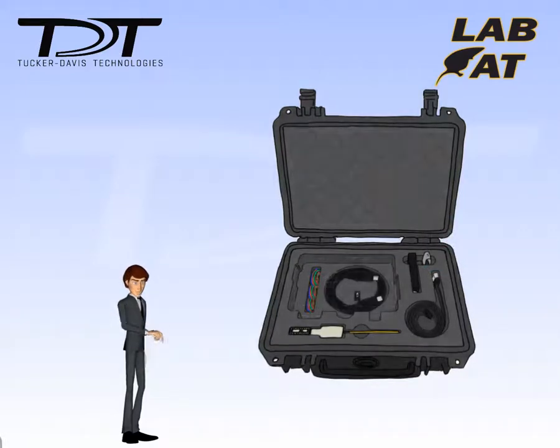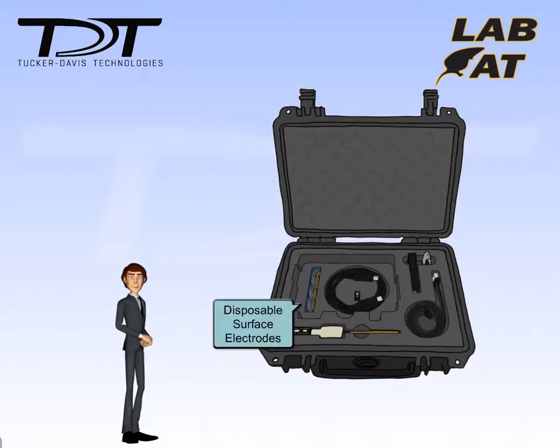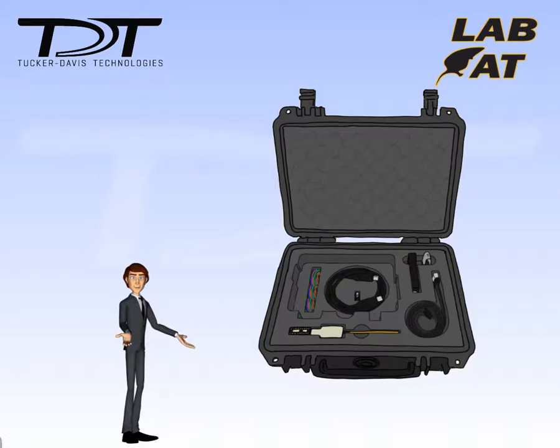Now remove the LabRat interface to reveal the USB Type-C cable and Type-A adapter. Also stored in this area are some disposable surface electrodes that we will be using in this demonstration.